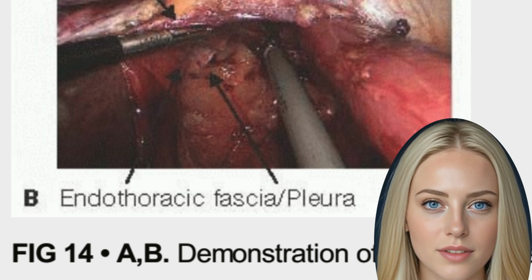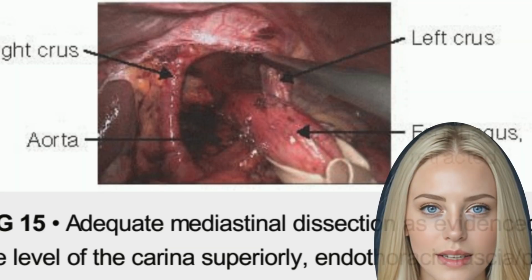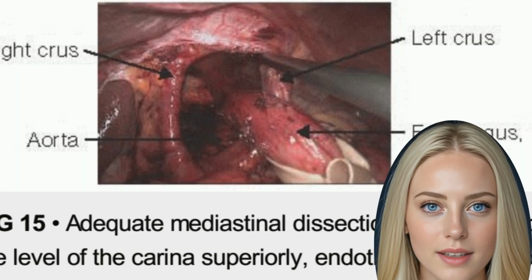Ultrasonic dissection takes place directly on the edge of the diaphragm at all times. Countertraction must be kept to prevent retraction of the hernia sac into the mediastinum.